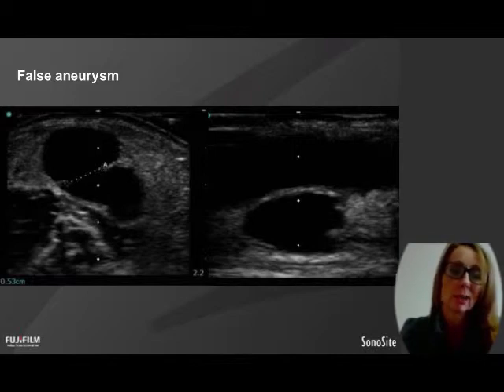The benefit of using ultrasound to guide cannulation is that you probably wouldn't have had this happen if you'd used ultrasound to guide the needling, because you would have been able to watch the needle tip and make sure that it didn't pierce back out the side or back out the bottom.